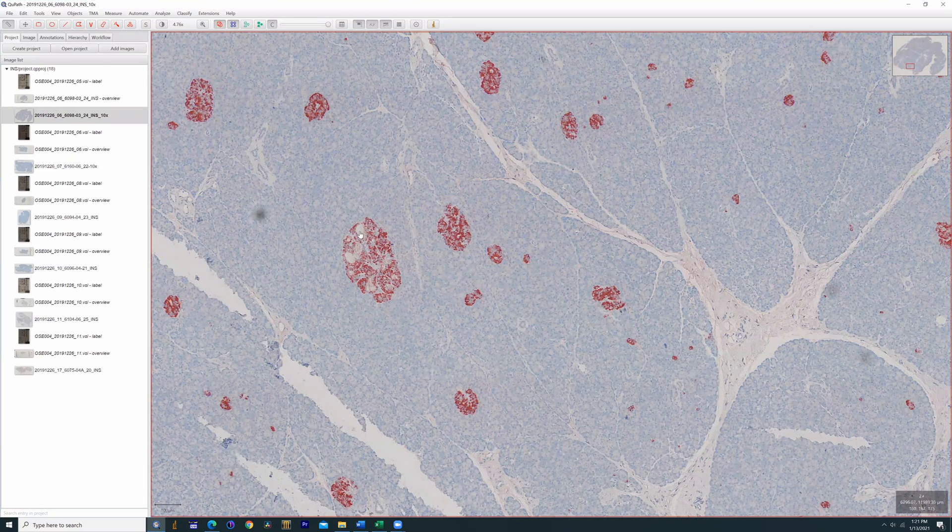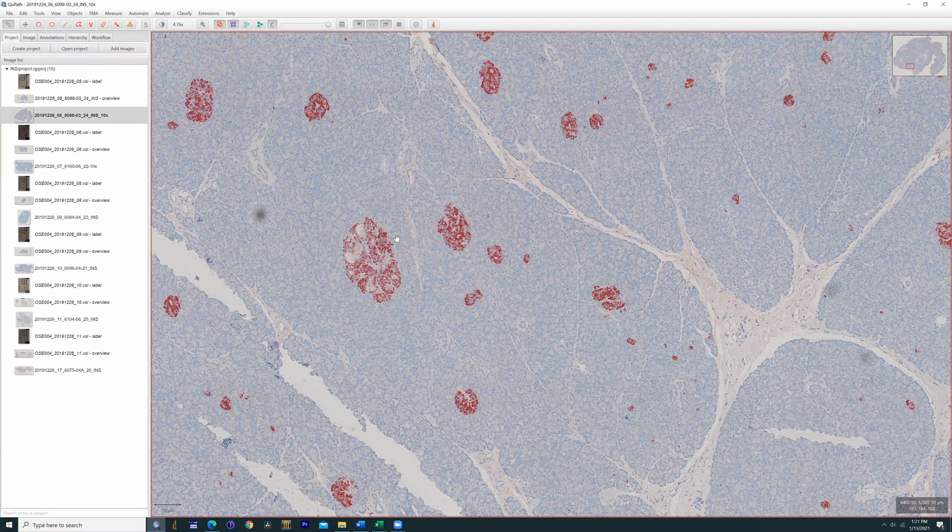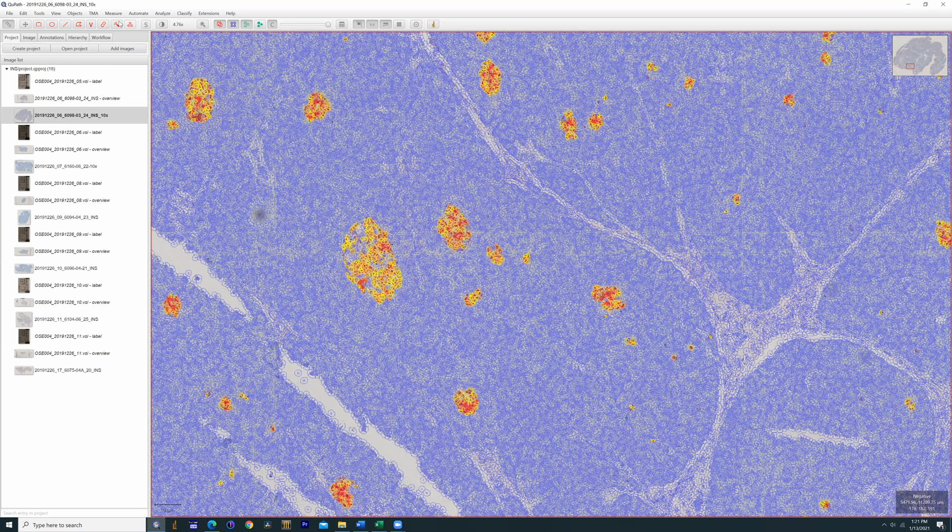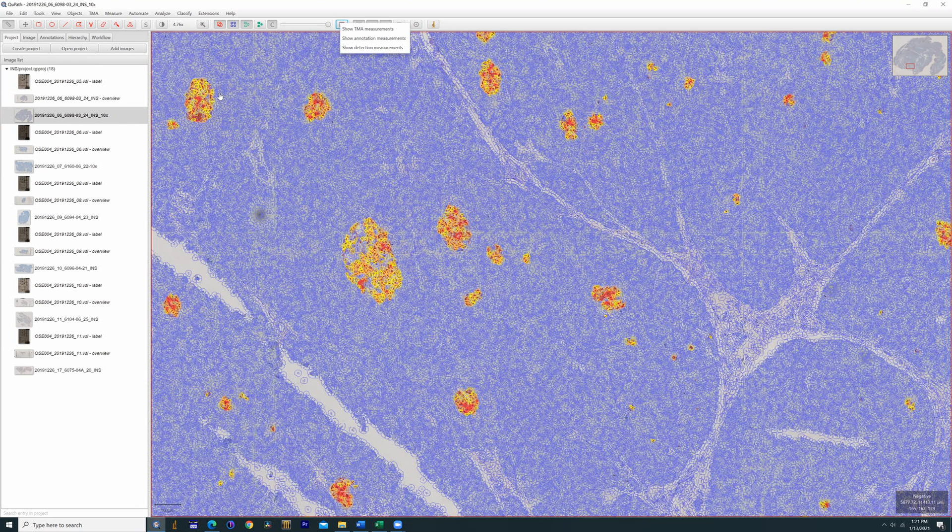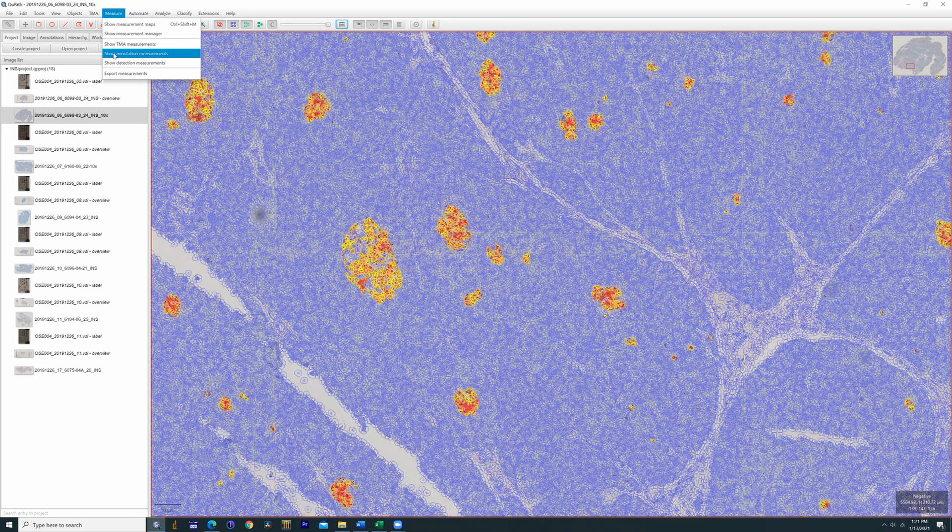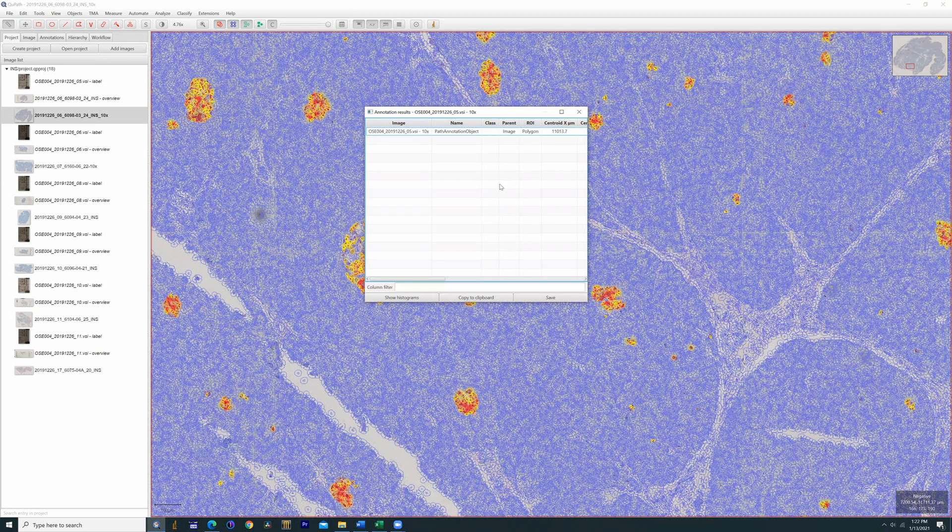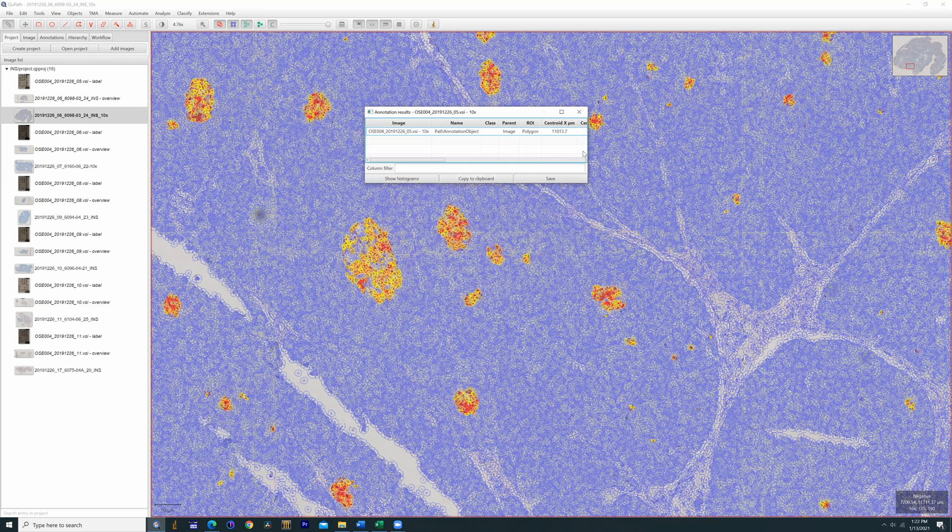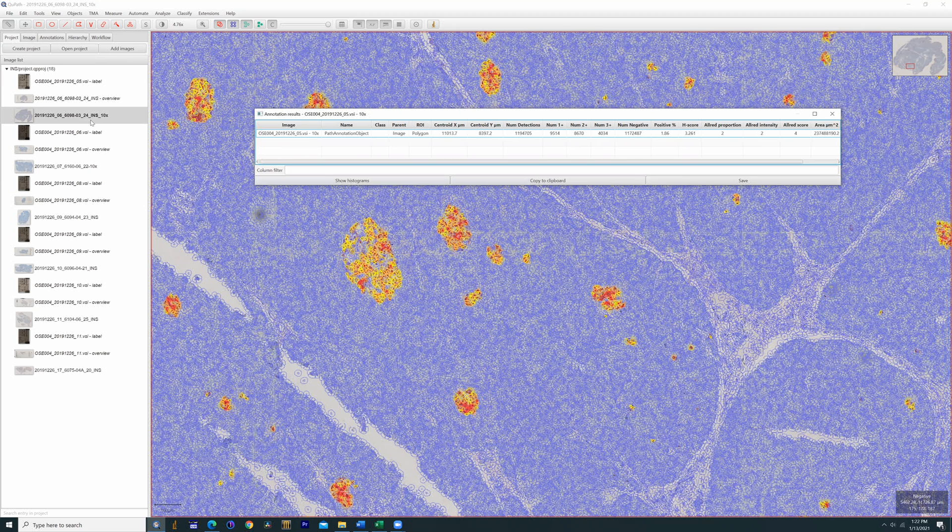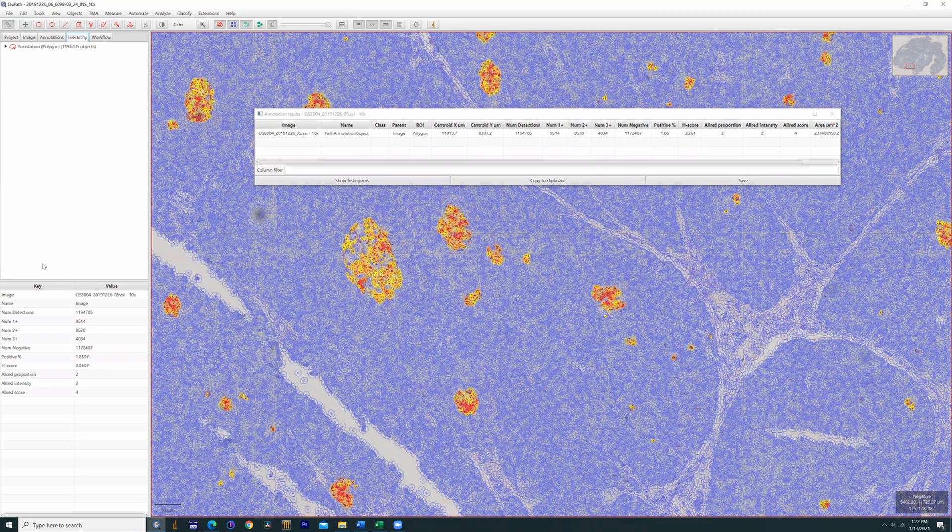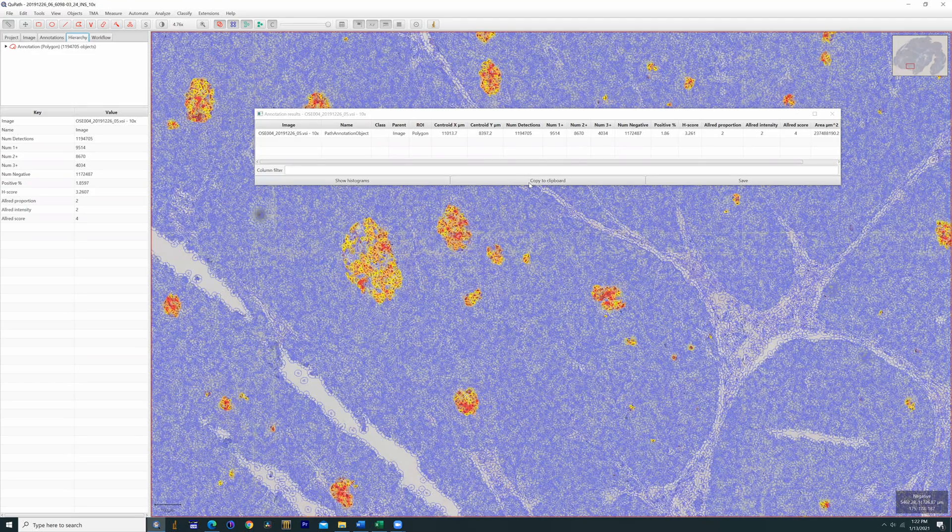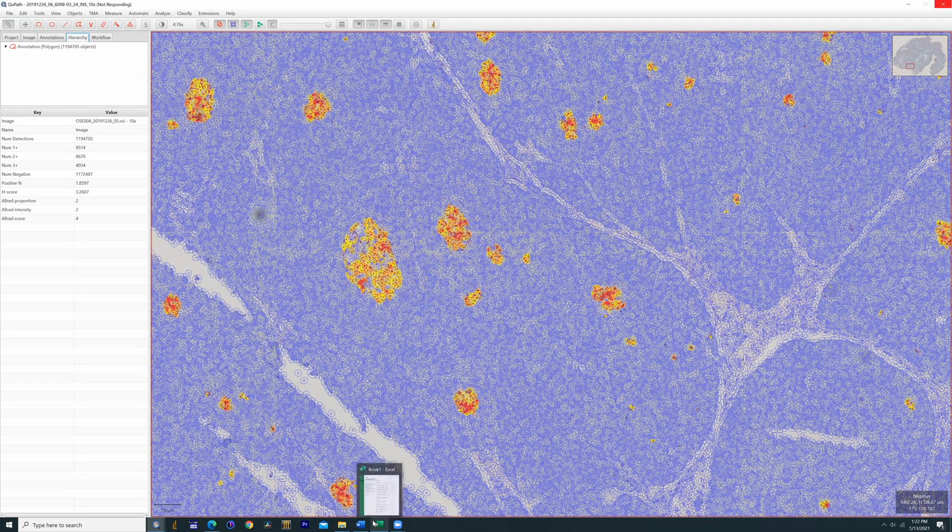The first one is, let's say we've gone in, we've measured everything, we now have everything labeled. There are several different ways to do the same basic task. The first one is we can either go under the measures tab or the measure symbol. We're going to stick with measures tab for right now, but essentially the same set of choices. You go under measures tab, you see we have show annotation measurement, which is basically show you the individual image that we're on right now with all the different measurements provided. This is basically the same information that's provided in the hierarchy tab. If you click on the annotation, same information.